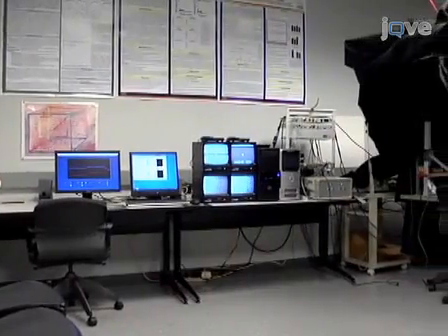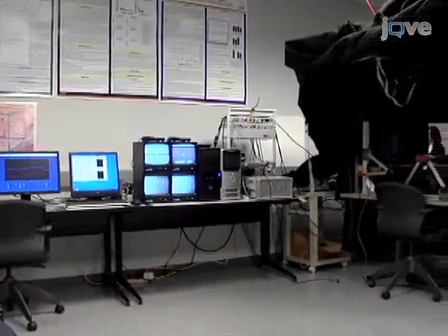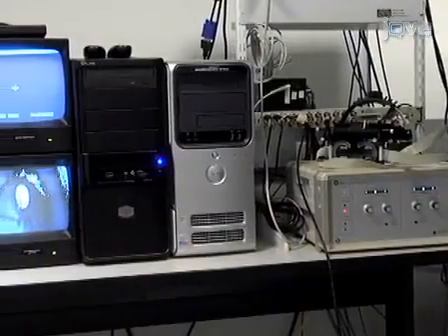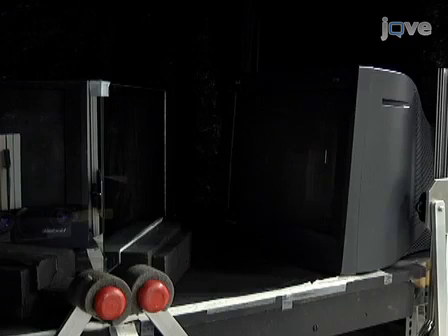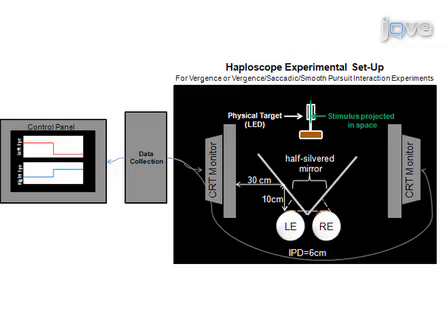Any type of eye movement monitor can be used for this system. In this demonstration, a limbus tracking and a video monitoring eye movement system will be used. For tandem tracking movements, such as saccadic or smooth pursuit, a single computer can be used for the visual display. To study opposing eye movements such as vergence or the interaction of vergence with tandem version movements, a haploscope is needed with 2 computer monitors for visual display.